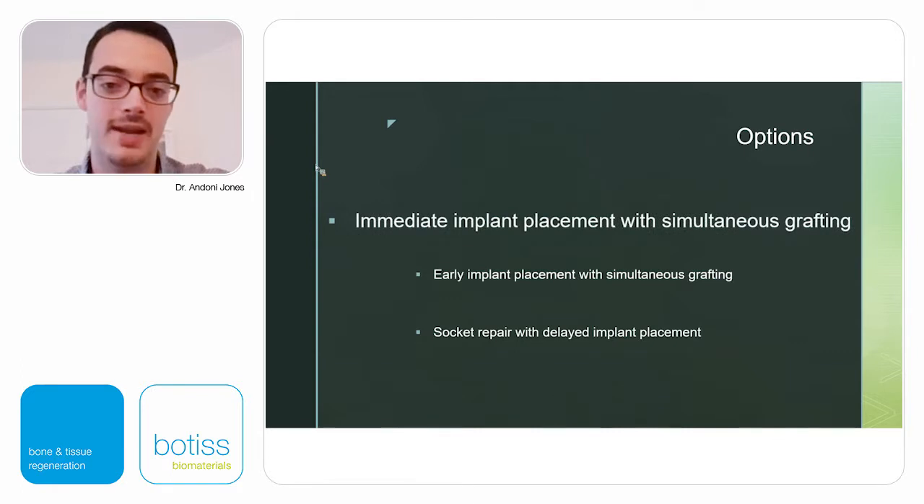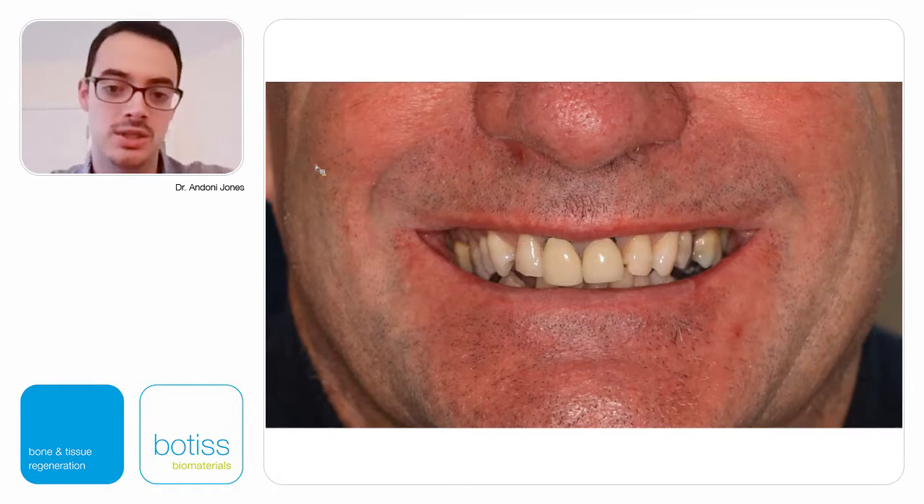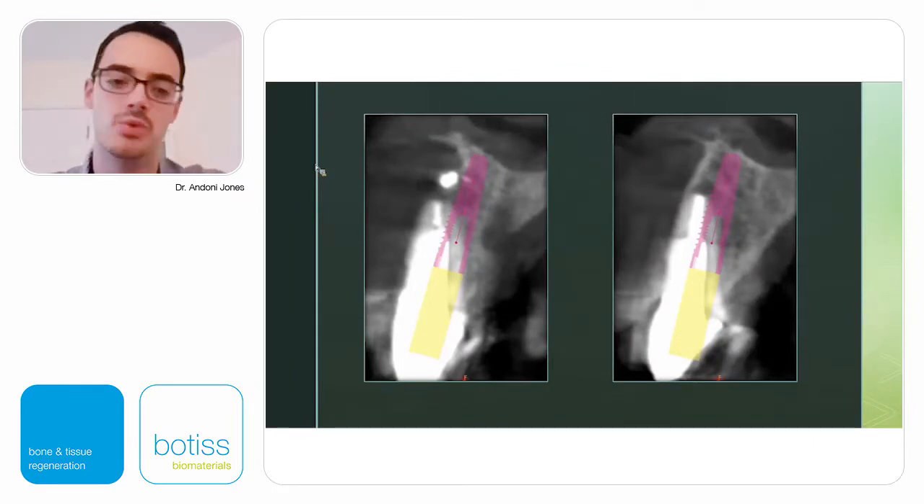We'll talk briefly about immediate implants with simultaneous grafting — can we place an immediate implant in a Type 2 socket? This male patient has two failing central incisors with some recession. The CT scan shows a likely missing buccal plate on the right central incisor and uncertainty on the other side. We have to be ready for the worst-case scenario: the buccal plates may be completely gone, or they could fracture during extraction. When this complication happens, we need to be prepared so it's not a surprise.